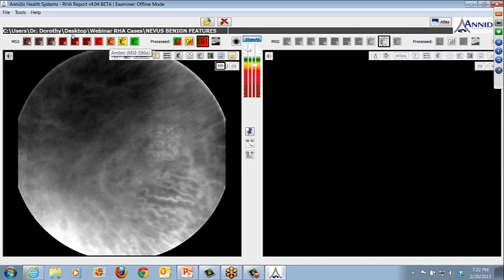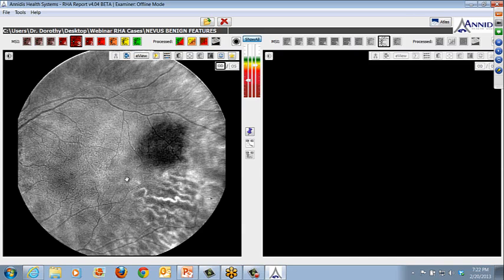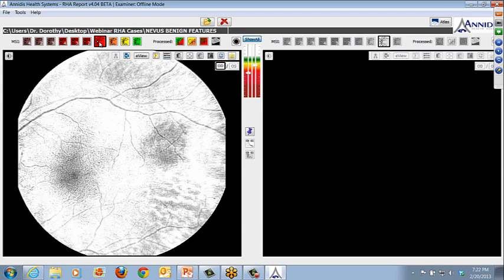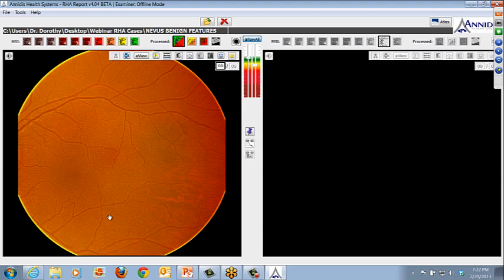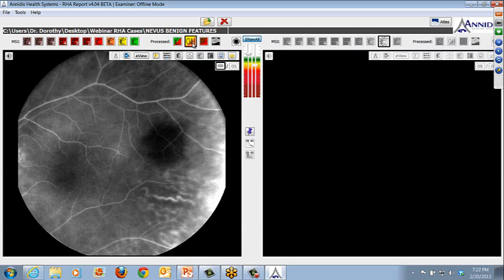So when you first look at these on MSI, they do look a little scary, actually. They all look like melanoma to me at first. But just keep those principles in mind. And again, if you have other modalities and you want to get a baseline, again, this is your profit center driving to your other modalities, then you can do some OCTs through this area. You can do depth analysis with OCT. That's actually quite nice in following these lesions.